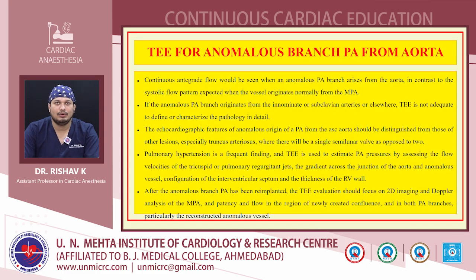So we have to see continuous antegrade flow when an anomalous pulmonary artery branch arises from the aorta, in contrast to the systolic flow pattern expected when the vessel originates normally from the MPA. So this is also a very important parameter that we can use to distinguish the origin of the anomalous PA from the main pulmonary artery or the aorta. In case of aorta, we will be seeing continuous antegrade flow, and in case of the vessel originating from the main pulmonary artery, which is the normal variation, we will be seeing the systolic flow pattern.